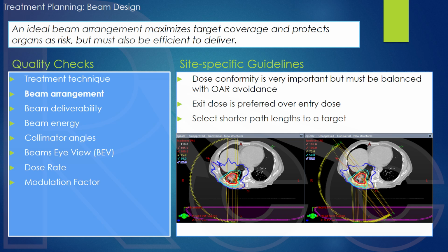But of course, the disadvantage is that you're going to irradiate the contralateral side of lung, and so that's really a balance. It's not meant to be 180. For our institution, we usually encourage a little bit over 180 degrees, like the second on the right figure. You want to go a little bit over to the other side to have some entrance beam there and to pull the isodose distribution to be a bit conformal. But there is no one answer.